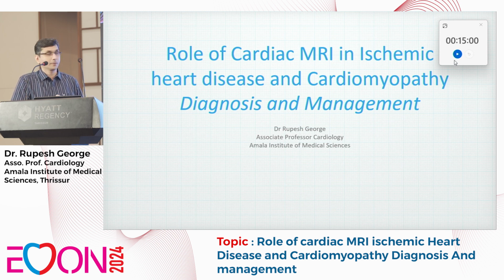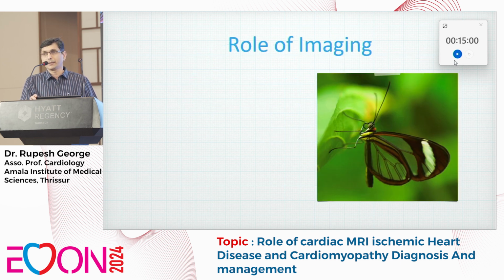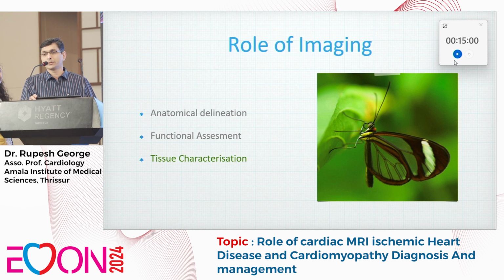So straight away to the topic, the role of cardiac MRI in ischemic heart disease and other cardiomyopathies. An ideal imaging modality should have good anatomical delineation. We should be able to assess the function of that organ and also the tissue characterization.